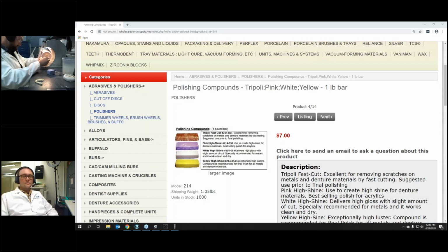Shouldn't really affect any kind of comfort. But if you were more concerned with that and making an easier to clean surface, you could print at 50 micron layers. And that would reduce kind of the stair steppiness or that surface topography. You have anything you want to add to that, Cory? Nope.